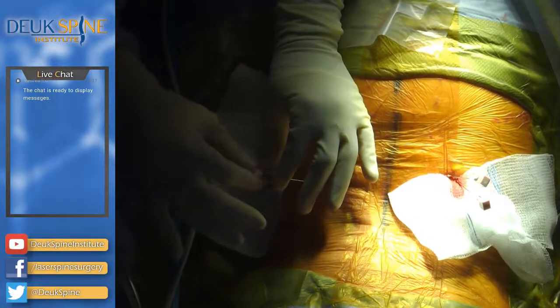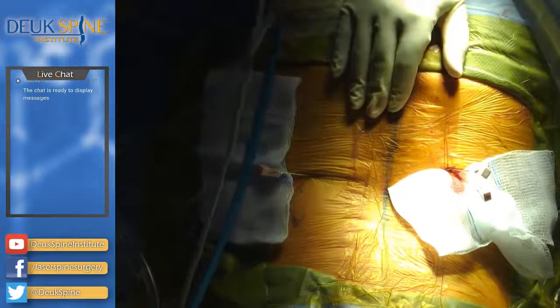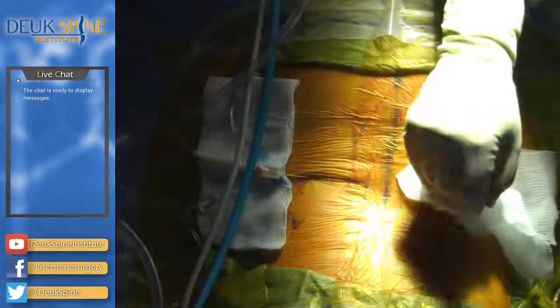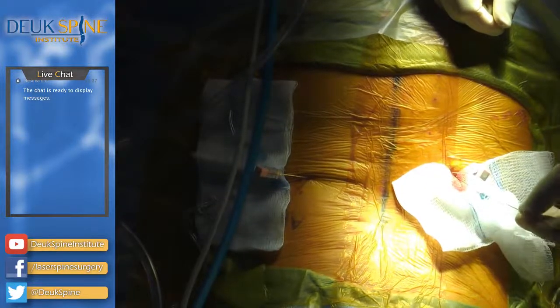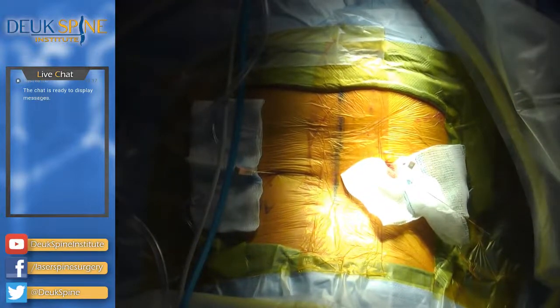I need to see 5-1. That's the first one we're going to do. Will you count out loud for me from 1 to 100, please? Out loud. Keep going. You're doing great. So I'm going to show you what we just did. We, you at 5-1? That's good.